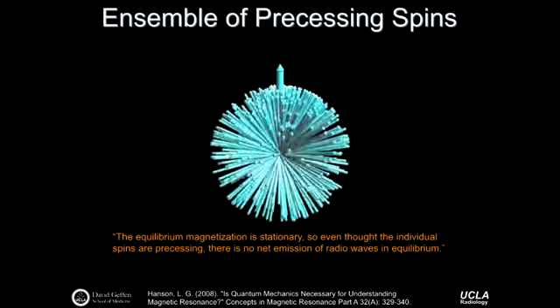I think I said it last time. Almost everything we need to know, and if you want to be a successful MR scientist, you can just work with the bulk magnetization, and everything works out quite well. There are some nuances that happen at the quantum level, but we'll talk about this principle of resonance both from a classical perspective and a quantum perspective.